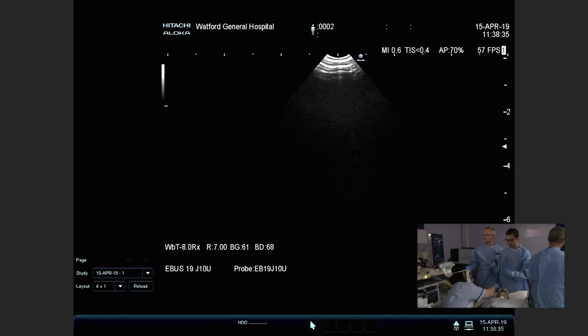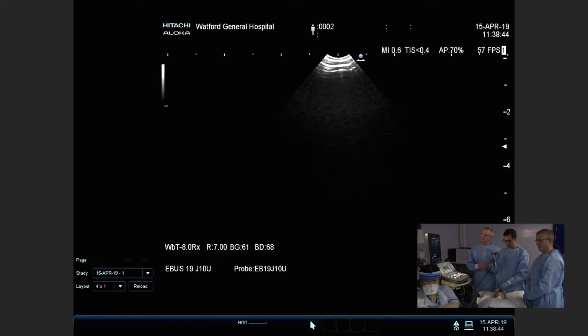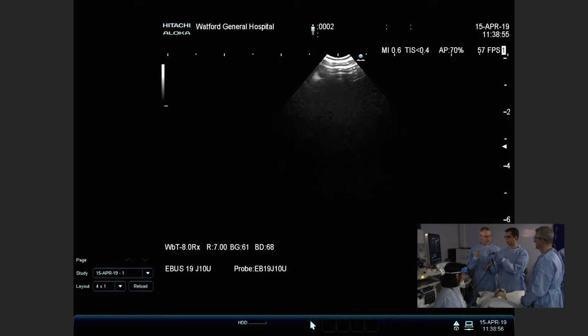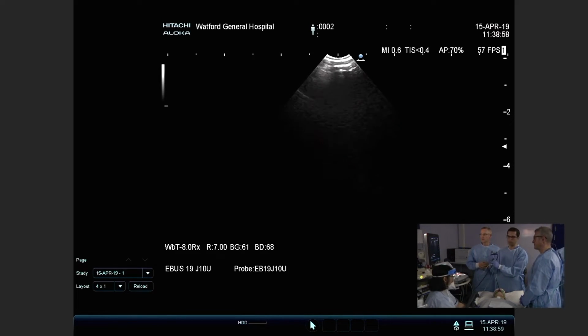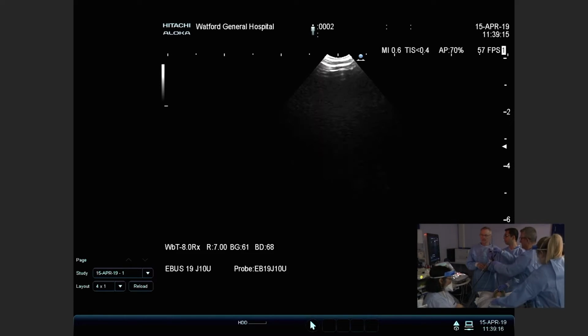Just a couple of things about the agitations. As I said, the guidance recommends between 5 to 15. However, at least I'm not aware of any studies where the exact number has been mentioned. Agitations, or jabs, as we put it in simple terms, while we're on the nodes, on average we do at least 20 plus in our practice. And the recommendation, where rapid on-site evaluation is not available, is at least 3 needle passes to be performed.